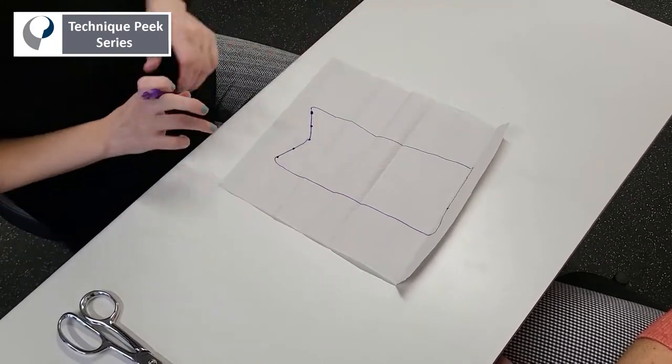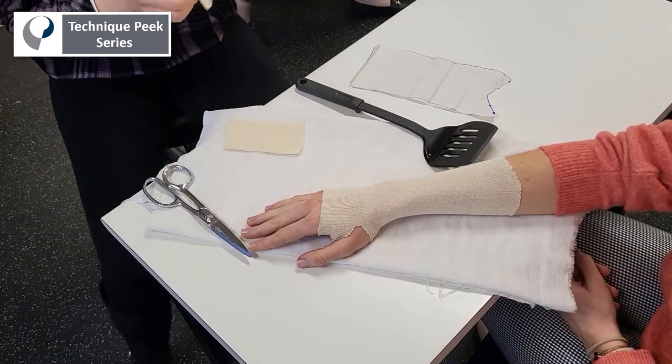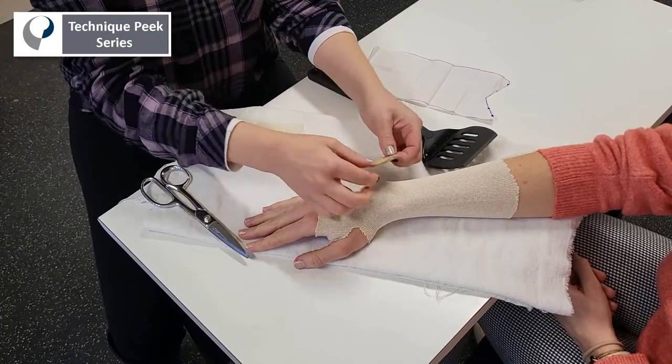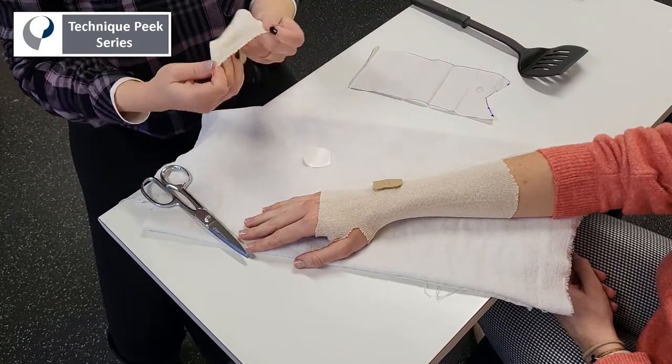Before fabricating the splint, you want to be sure to pad any bony prominences. In this case, the ulnar styloid is a common site for irritation. Use some foam padding, and a little tip is to cover it with an extra piece of stockinette so it doesn't stick to your splinting material.